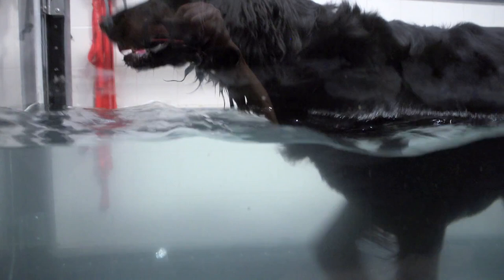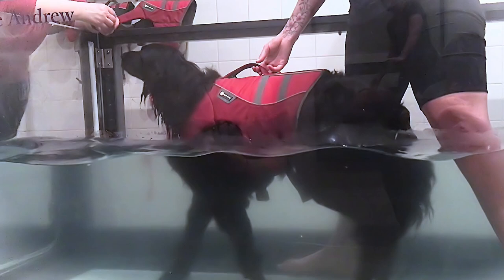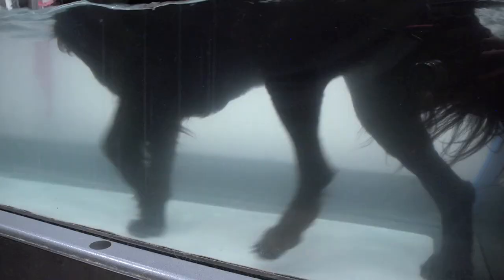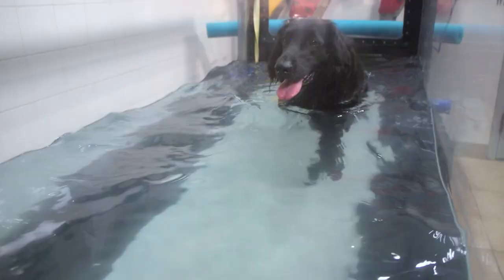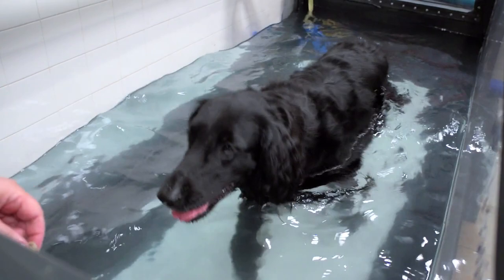It's really good for dogs that have arthritis. Any time you can build muscles surrounding arthritic joints, it takes stress off of the joints and it makes them more comfortable. So we always go in with them in the very beginning — we put a life jacket on them and use a lot of treats and positive reinforcement, and we go in with them to give them guidance and support. Once they become more comfortable, we get out of the water and just use treats and toys. And because the owners are always present, it's a really nice bonding experience because they can play a role in the healing of their pet.